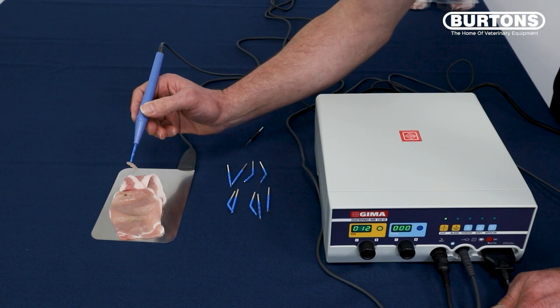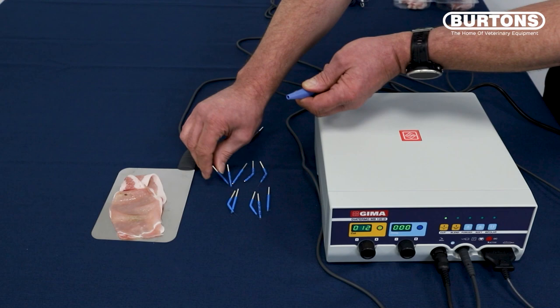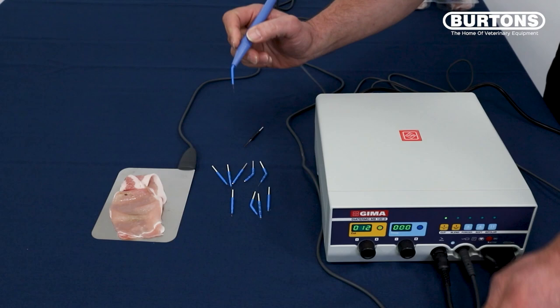Change the tip to one of the fine wires. Foot on the foot pedal, finger on the yellow button, and you get a much finer cut.